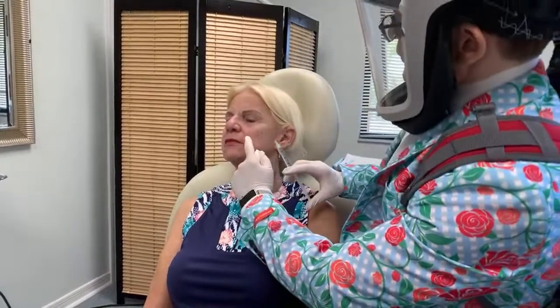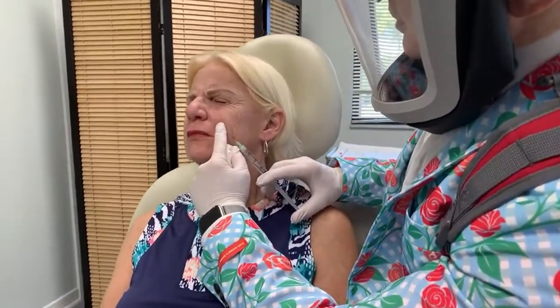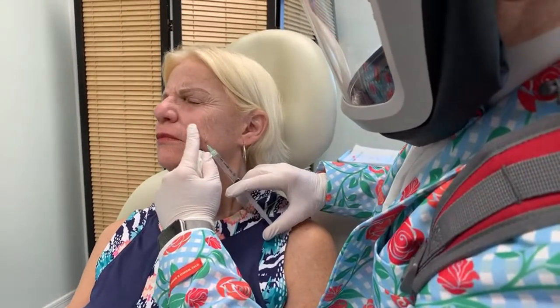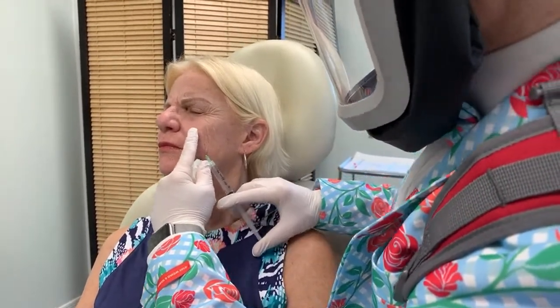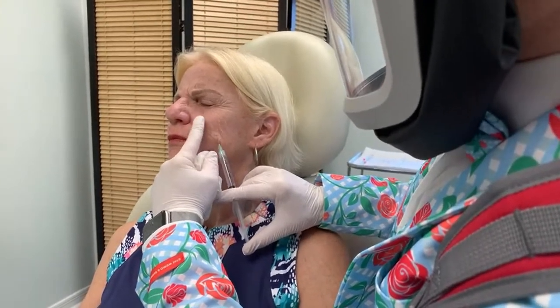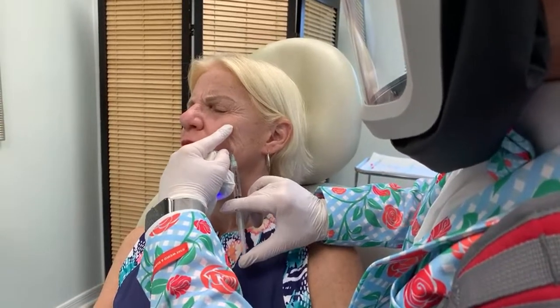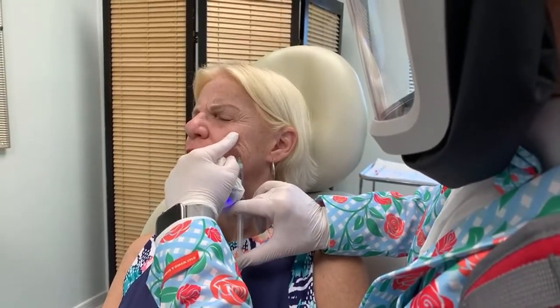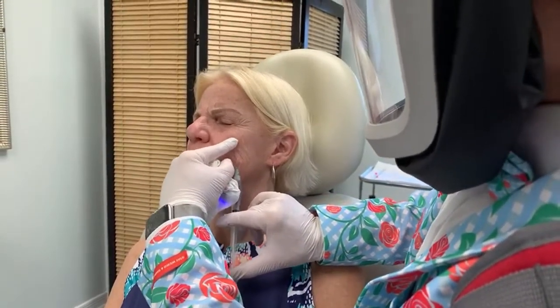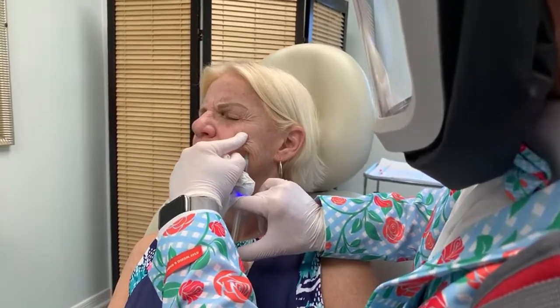That's a great question. So you'll feel a buzz, pinch on 3. 1, 2, 3, pinch. All right, pinching. We'll go slowly. We're not in a hurry. Do you feel small, medium, big pinch there? Not too bad? No. Everything's looking good, and I am feeling where, and I'm also directing the tissues as I'm injecting. I can direct where the numbing medicine will go.